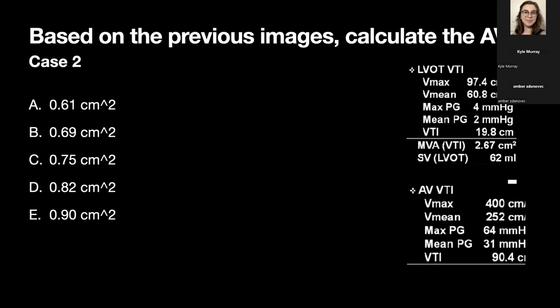Because you can calculate the big cylinder, and the big cylinder becomes the small cylinder. Okay, that's the big cylinder. But what of the cylinder are you calculating? What metric of that cylinder? The height. So the VTI is the height, and the area is the area.